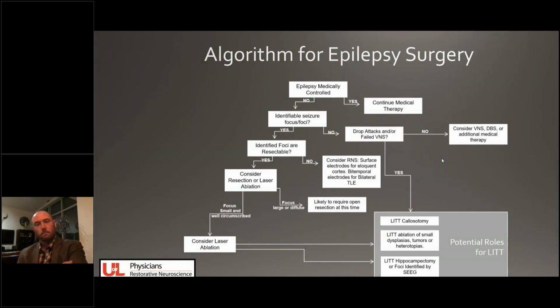Given the incidence of repeat procedure for epilepsy treatment, where do you see LITT versus resection fitting in an algorithm? Is it difficult to resect after LITT if a patient remains refractory with a further focus? Do you find resection will remain first line?